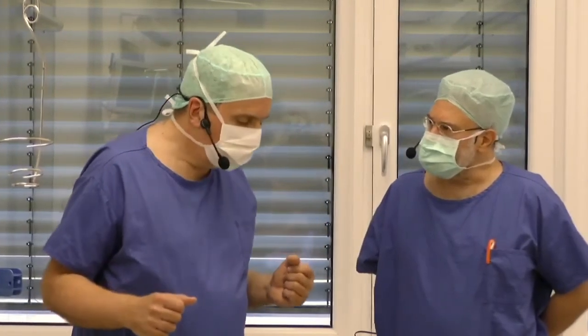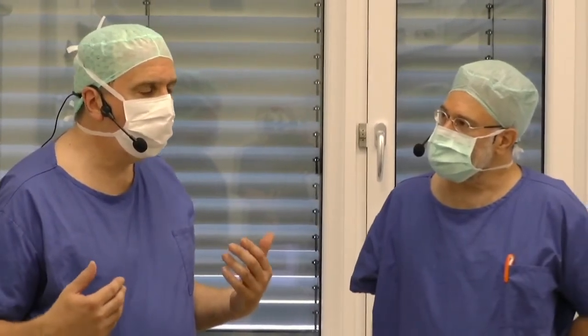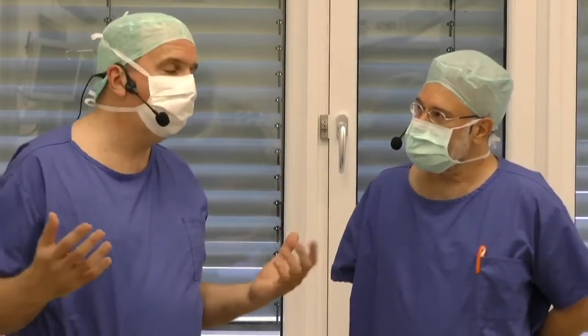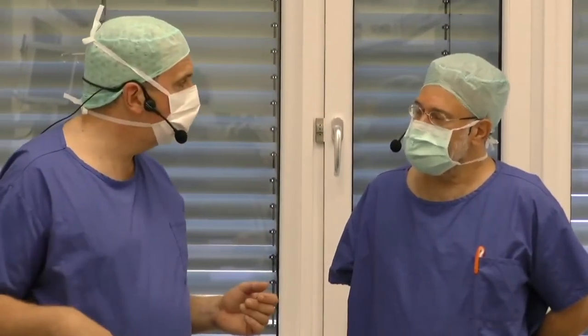So you feel that this lens system gives you more flexibility with younger patients? It gives me more flexibility with younger patients. It gives me more flexibility to adapt a system. I'm convinced that the visual acuity of two lens systems is better. You have less negative photopsia, you have less glare. Yeah, the patients are very happy with this.